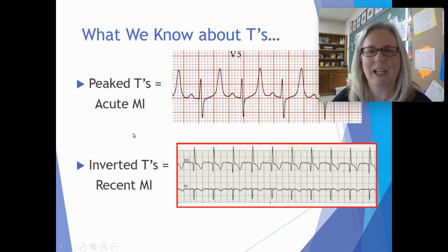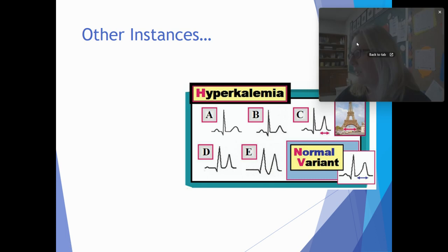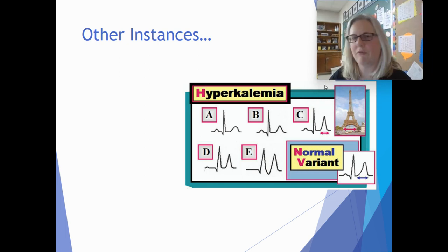All right, so what other instances can we use these for? Let's see if I can move this just a tiny bit. I want to make sure you guys can see everything I have on the screen for you.